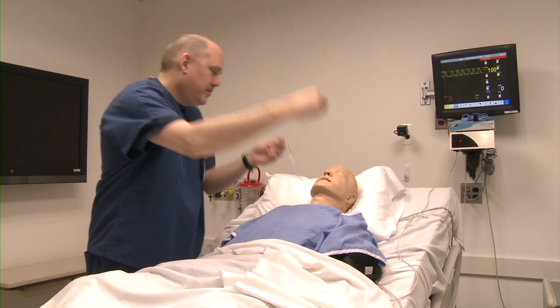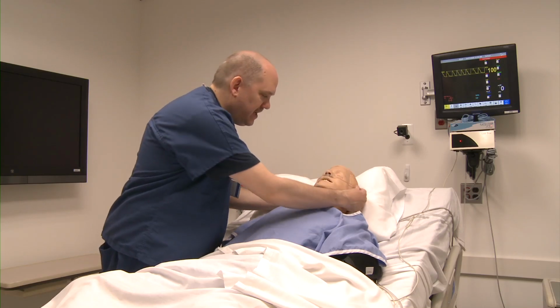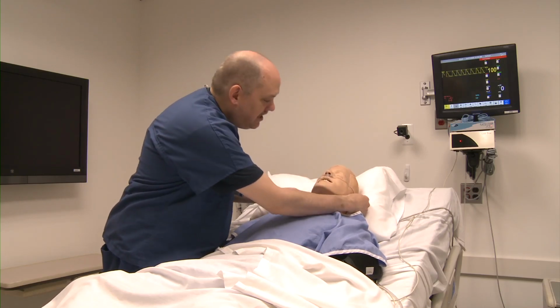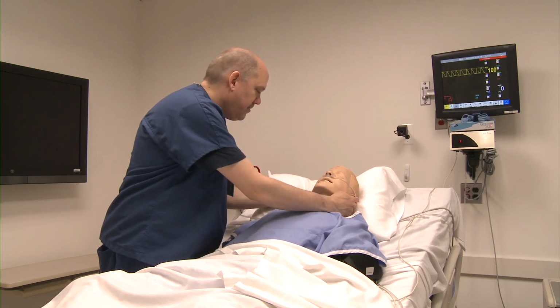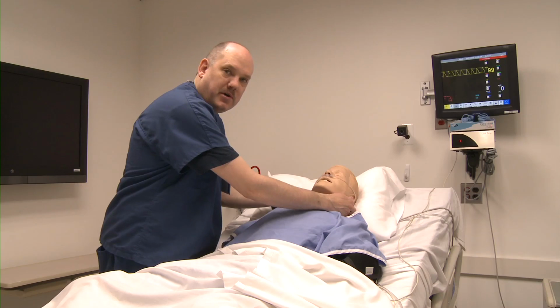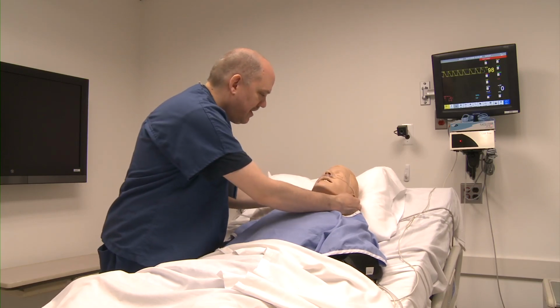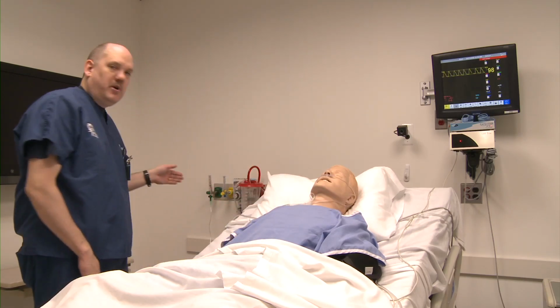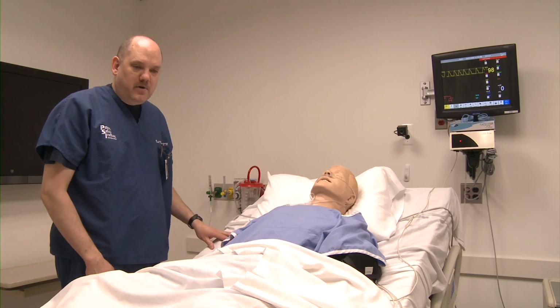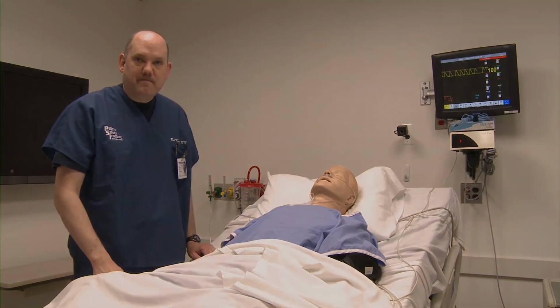The nasal cannula goes in the nose, and very often you have to finesse it a little bit to get it to stay on his ears. His ears do not hang out from the side of his skull very prominently, so you kind of have to coax it into the little cracks there. Please make sure that your oxygen is turned on and set to an appropriate liter flow, and of course reassess your patient using the pulse oximeter.